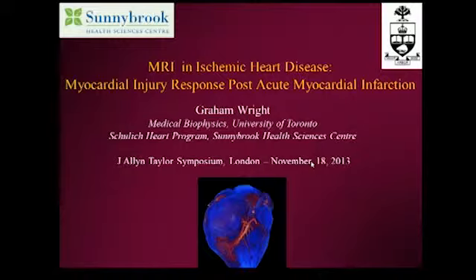Now, as I think we all know, with acute myocardial infarction, or heart attack, the most important thing if one is suffering a heart attack is to get revascularized as early as possible. As the saying goes, time is tissue. What these images reflect is that as time goes on, you get more and more damage to the myocardium, which is this dark ring in an MRI image.